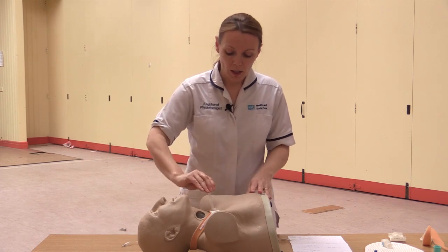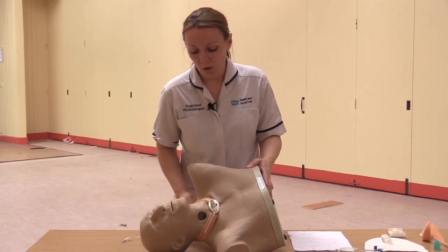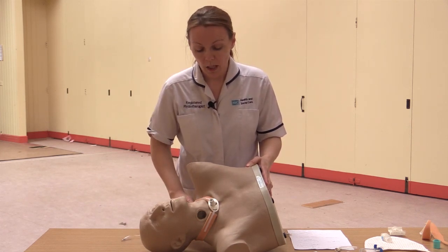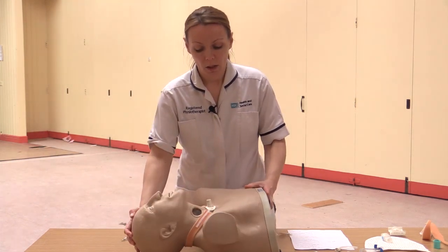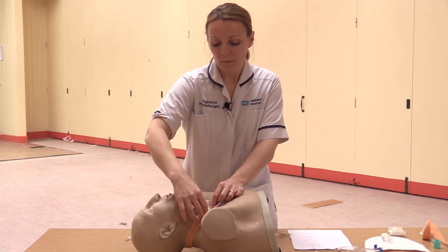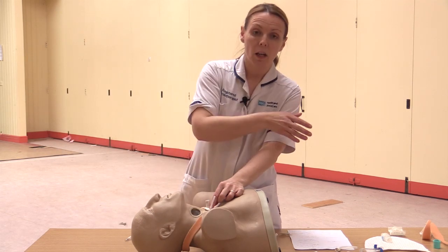So just some general care of the trachea as well. If they have a tracheostomy in place, it will be secured by two neckties. You want to keep them nice and clean and dry, and you can change them accordingly. If you are going to change them, it is recommended that it's a two-person job, because one person needs to stabilise the tracheostomy tube while the second person undoes the tapes and redoes them, because once the tapes are loosened, if the patient coughs, the tracheostomy tube could be dislodged.